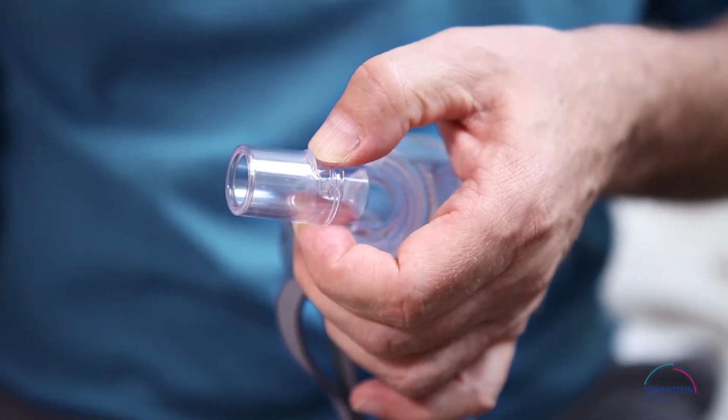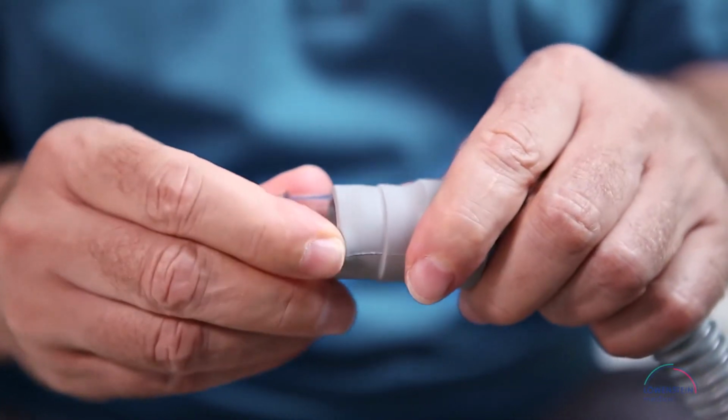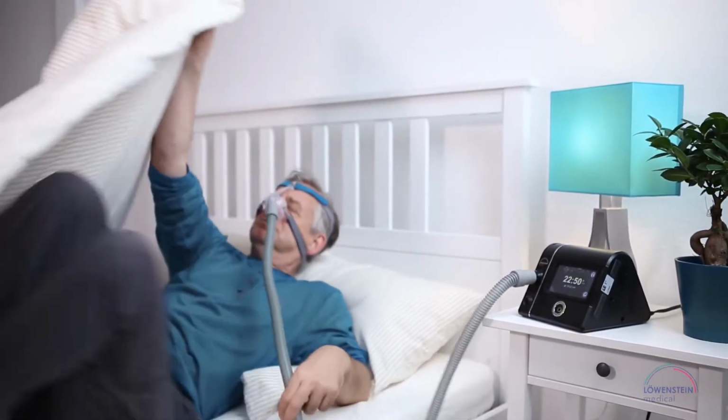If the rotating sleeve is still on the mask, remove it and insert it in the tube. Connect the tube to the mask and lie down on the bed.